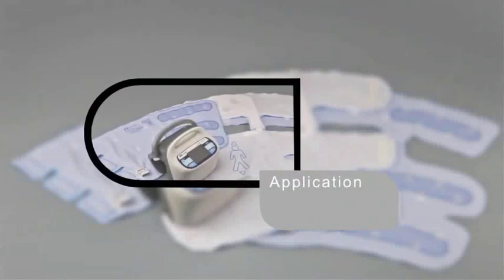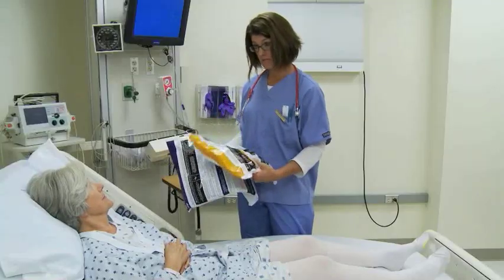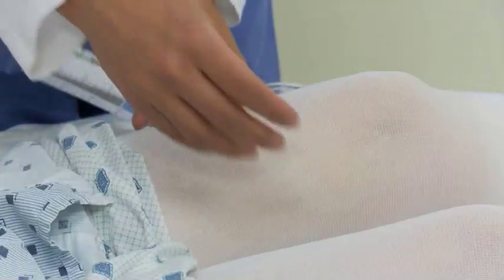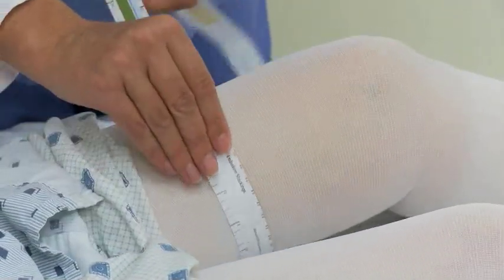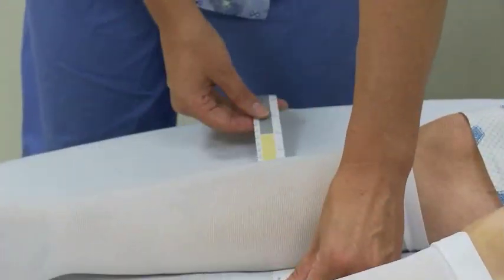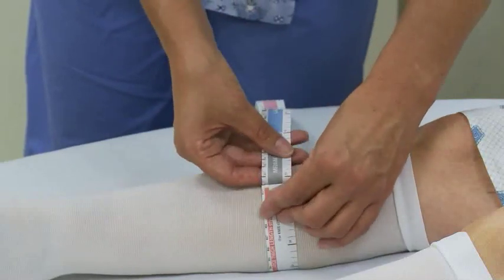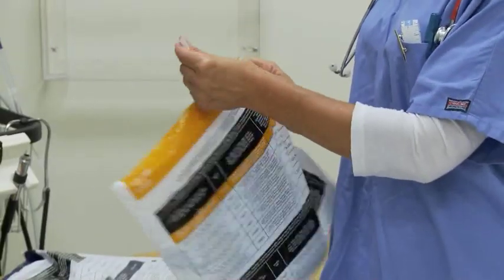Sizing is quick and easy to do. First, determine the length of the sleeve based on physician prescription of knee or thigh length sleeve. For thigh length, you must measure the circumference of the thigh. For knee length, measure the circumference of the calf. Sizing information is clearly marked on the product packaging once sizing is determined.